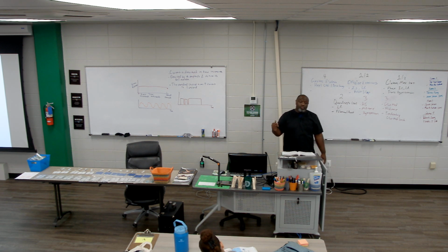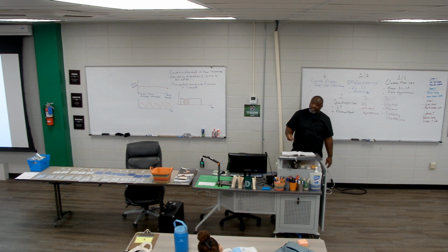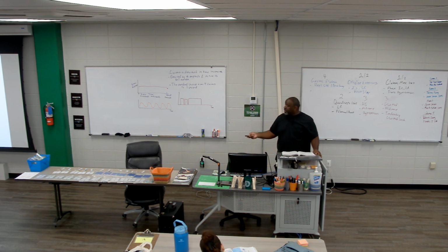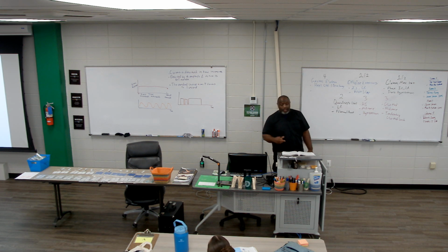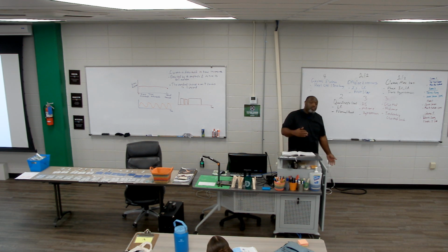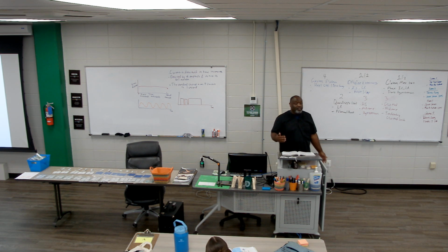So we choose a waveform to accomplish our objective, but our patient isn't going to be able to decipher, oh, that's polyphasic, oh, that's biphasic, oh, that's monophasic. They won't be able to tell. It's all going to be packaged and delivered to feel the same to the patient. So they won't know. You will know because it's going to be specific to why you're using it for your treatment. So we'll dive deeper into that once we get further along.